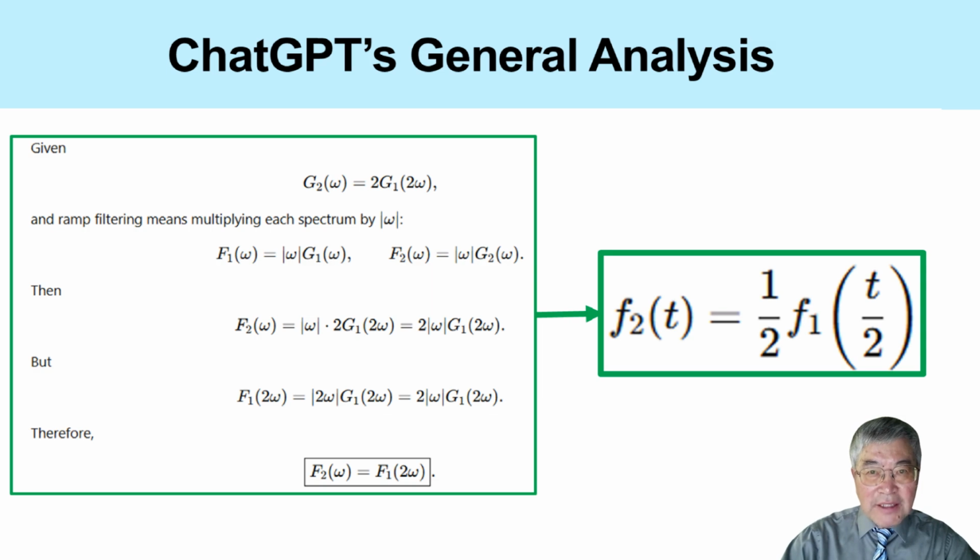Now we can understand why the fan beam filter backprojection formula contains a squared geometric factor. One factor comes from converting the angular variable. The other factor comes from the scaling behavior after ramp filtering. With this insight, the fan beam formula is no longer just a complicated mathematical expression. Each weighting factor has a clear meaning, either from geometry or from signal processing.